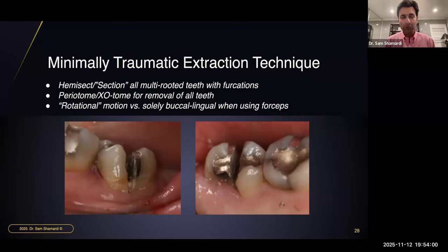What we were taught when we were in school was always not only to put apical pressure, but the heavy bulk, 2/3 of our force, was always told to go towards the buccal and then to the lingual side. Well, again, when our buccal plate is our most delicate area, our thinnest area, and the area that results in the most functional and aesthetic changes, why on earth am I going to put the most amount of my force in the area that I am trying to protect?